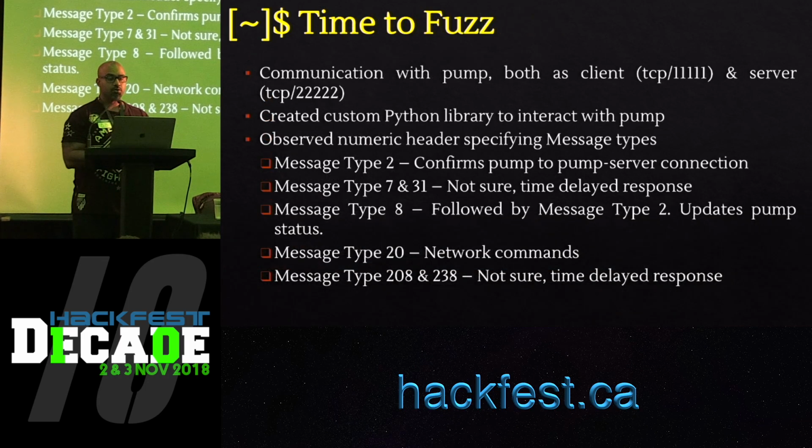There was a message type 2, which confirmed to the pump that it is now connected to the pump server. If we receive a packet from the Infusion Pump, modify it, and send a message type 2, it will confirm to the pump that it is now connected to the pump server. There were message types 7 and 31, which we're not really sure what they were. Message type 8 was usually followed by message type 2. Once you send those messages, it changed the status on the Infusion Pump from listening to confirmed. Message type 20 was something to do with network commands. And message types 208 and 238, we're not really sure.